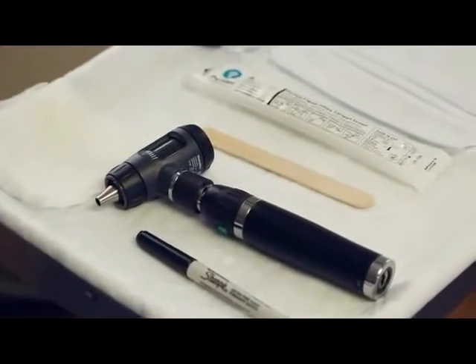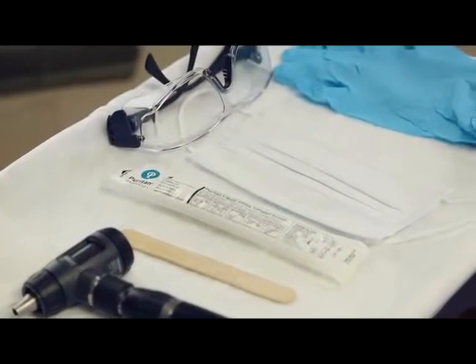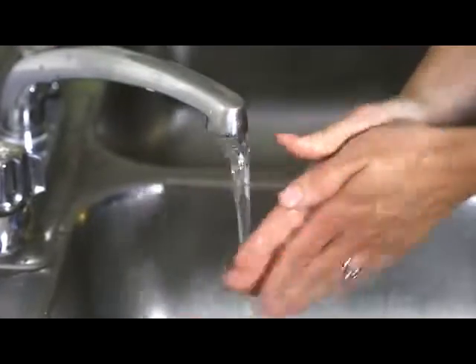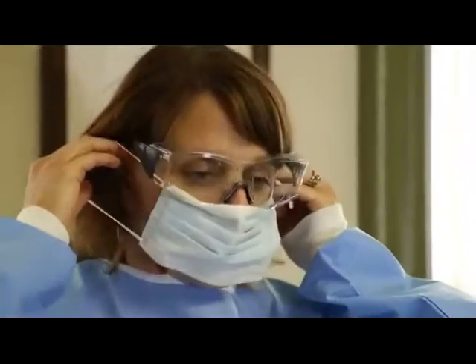It is recommended to wear appropriate personal protective equipment — gloves, surgical mask, and eye protection — when collecting samples. Wash hands. Put on gloves and surgical mask.